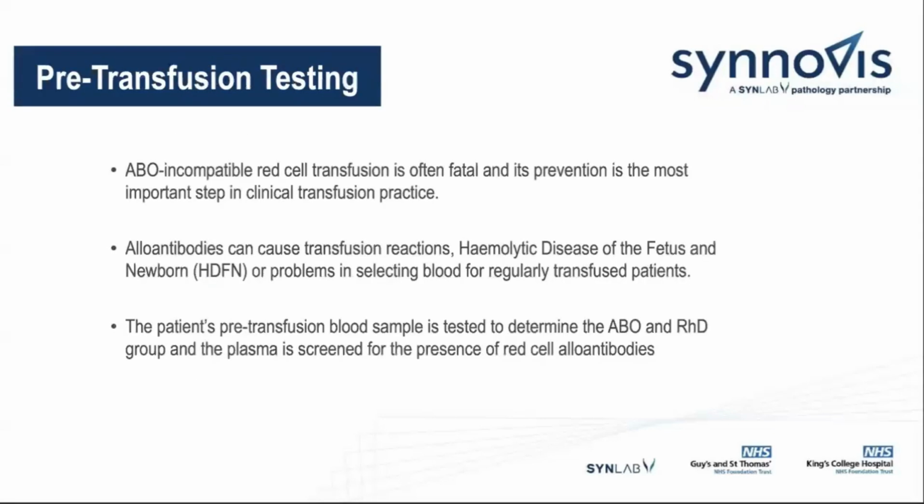So why is pre-compatibility testing so important in blood transfusion? It's important for a number of reasons, because we want to ensure that we do not have an ABO incompatible red cell transfusion. This is often fatal, and prevention is the most important step in clinical transfusion practice.